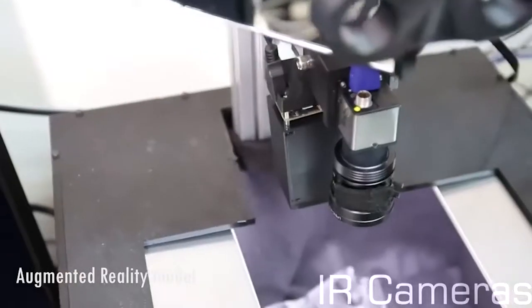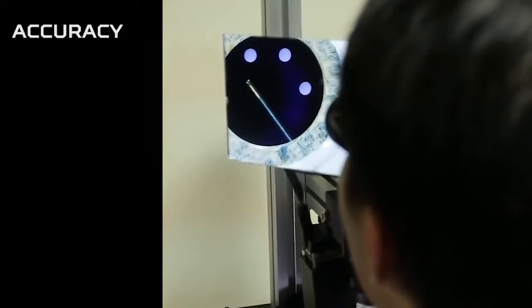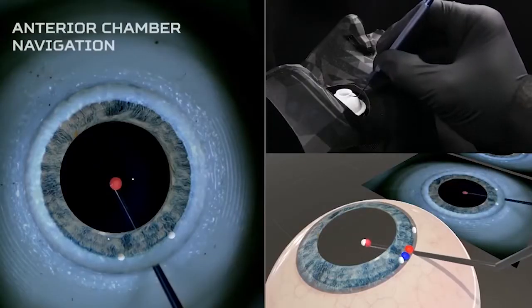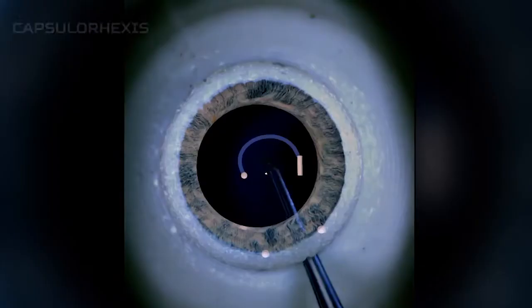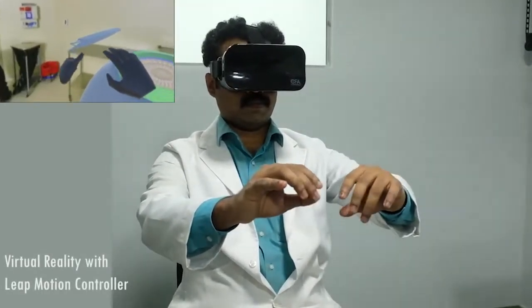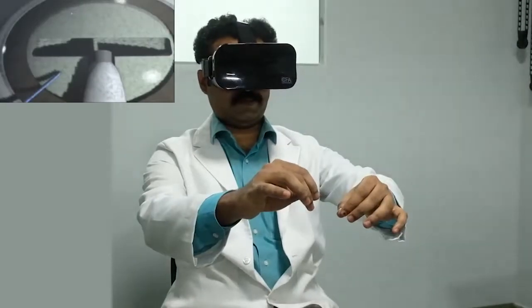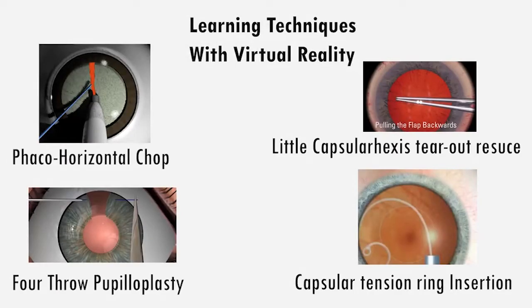Augmented reality. Once a figment of the imagination, augmented reality is now one of the most promising digital technologies. It has not only revolutionized the field of entertainment, retail, and education, but it has now come to the field of ophthalmology as a cataract surgery training system with dexterous instrument tracking technology. Although the virtual simulator is a much more sophisticated tool for surgical training, it is limited to specific simulated task training rather than comprehensive training. Though feedback sensation may not be perfectly realistic, the cerebellar training through reiterated movements is beneficial.